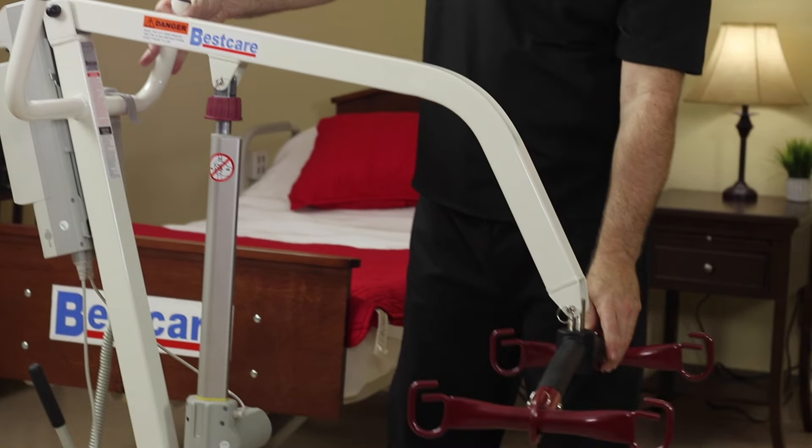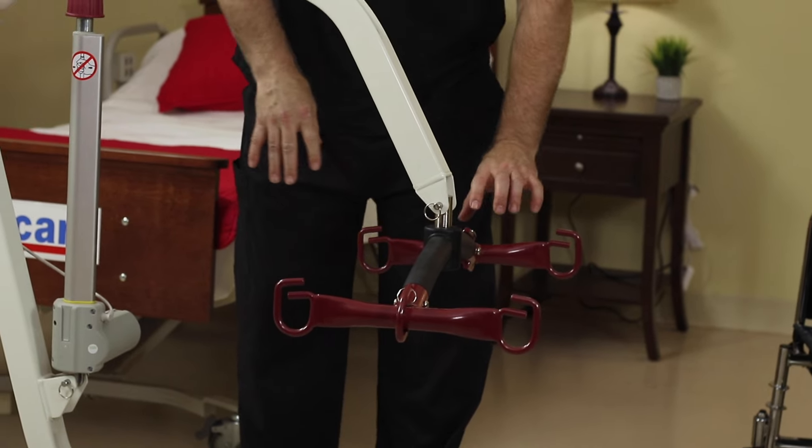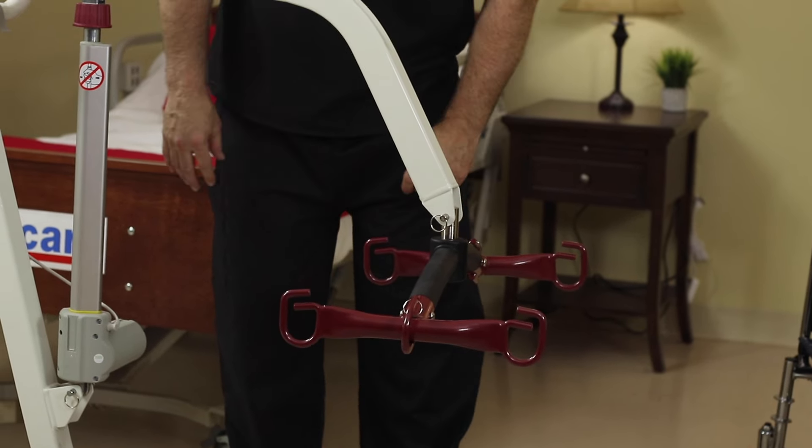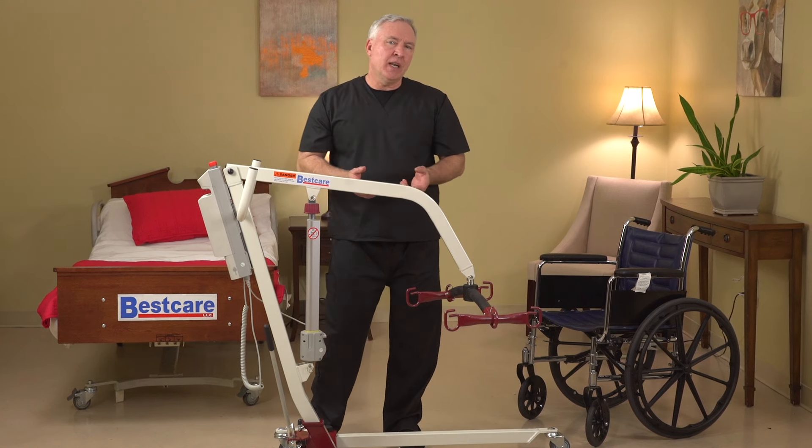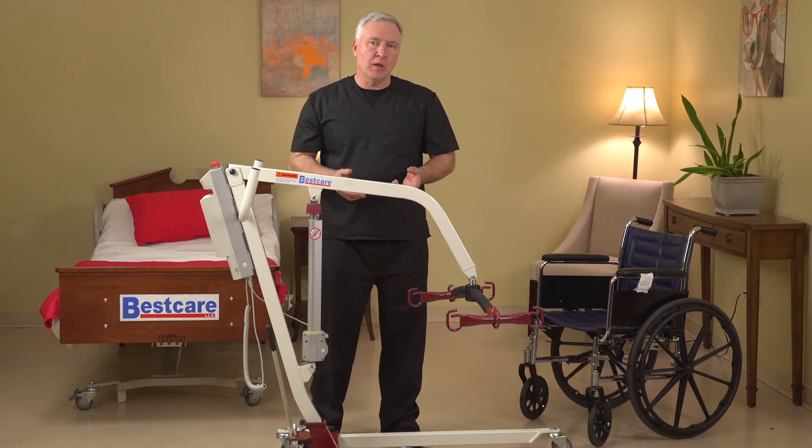As I mentioned earlier, the spreader bar is going to be a fixed spreader bar. There will be rotating ends on the spreader bar, so it'll make it even more convenient and easier for you to adjust the range and positioning of the patient with our slings.